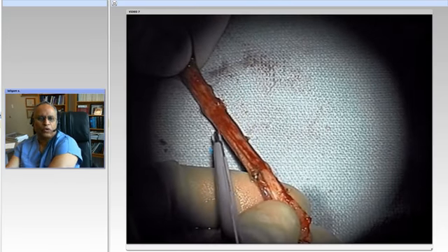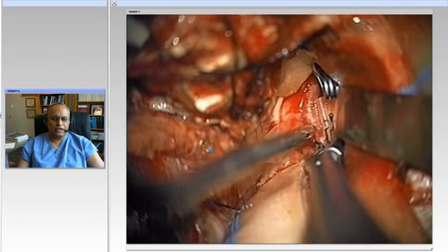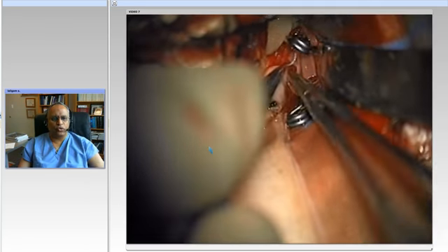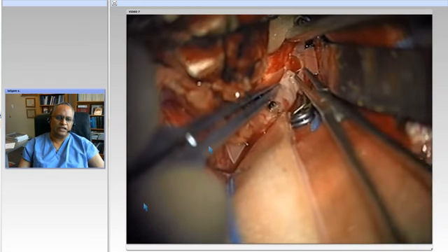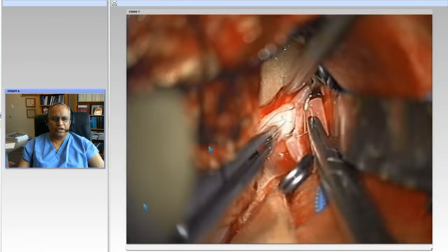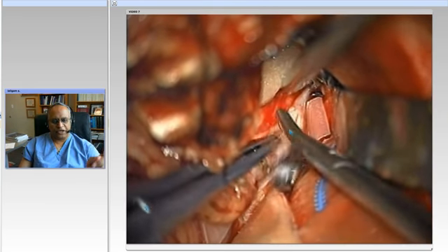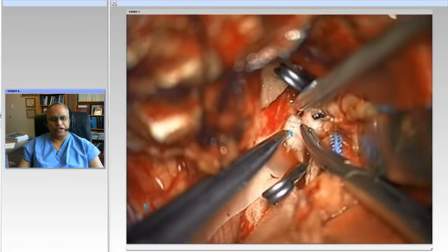Which one is this? Oh, so here we see what's called a pressure distension technique, and then trimming the radial artery. You're going to see more of this again. So just different shots, and then we suture the distal end first, like you see here. After having made an oval arteriotomy in the middle cerebral artery, here's a radial artery graft. And then we will use continuous sutures usually, or sometimes interrupted and continuous sutures.